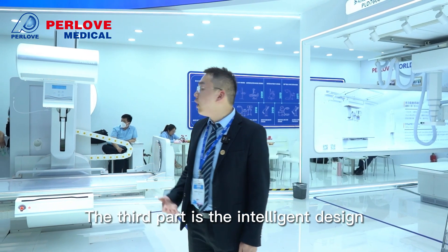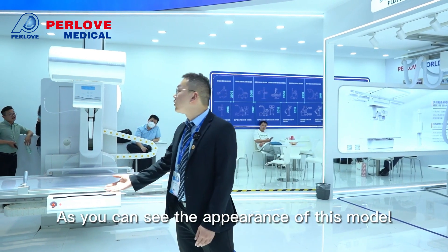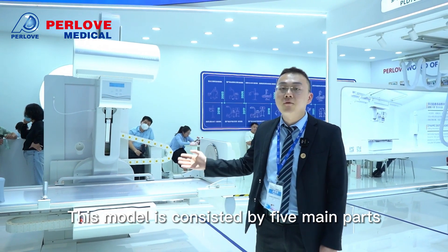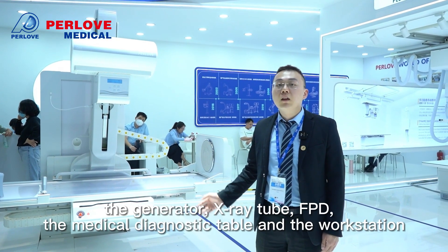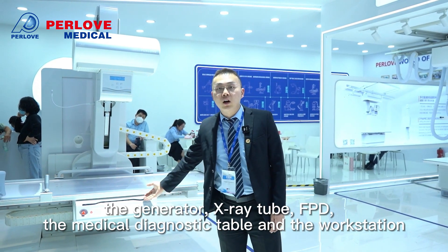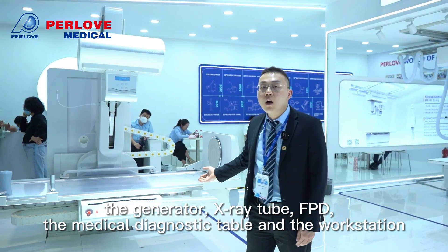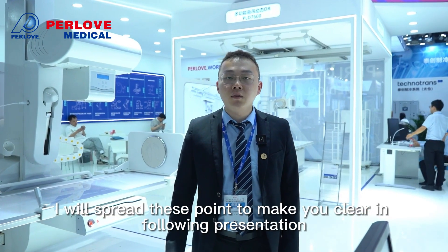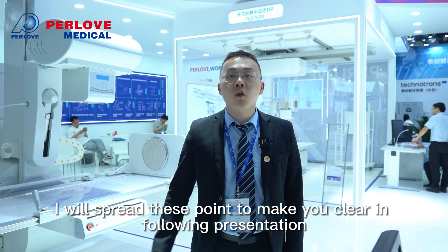The third key point is the intelligent design. As you can see from the appearance of this model, it consists of five main parts: the generator, the X-ray tube, the flat panel detector, the medical diagnostic table, and the workstation. I will go through each of these points to make them clear in the following presentation.